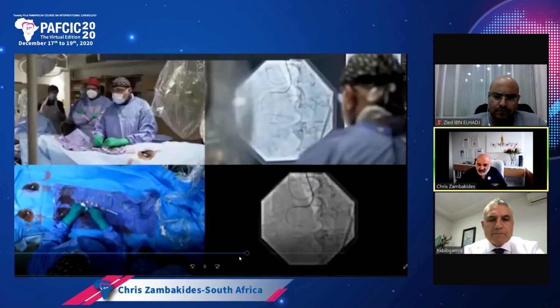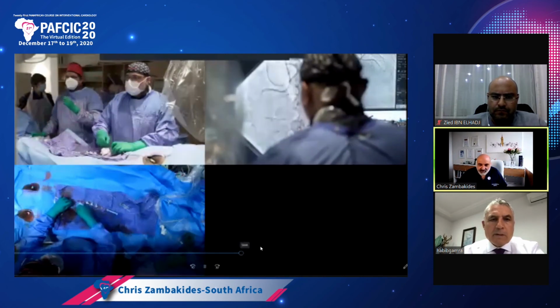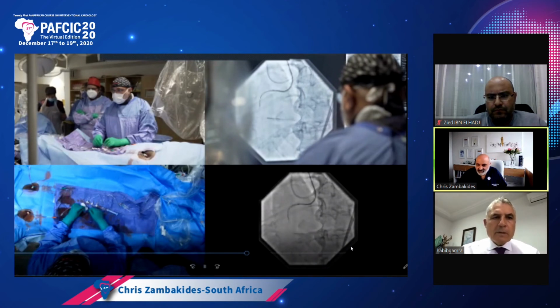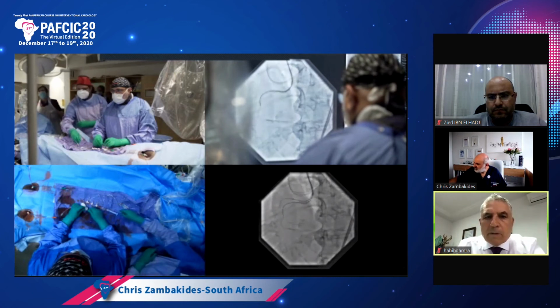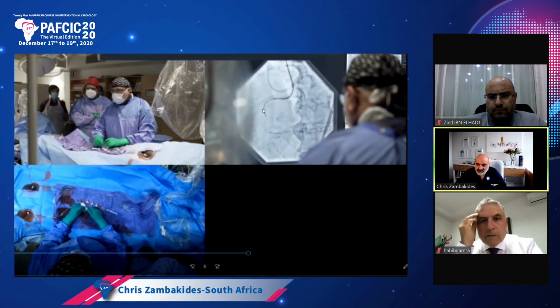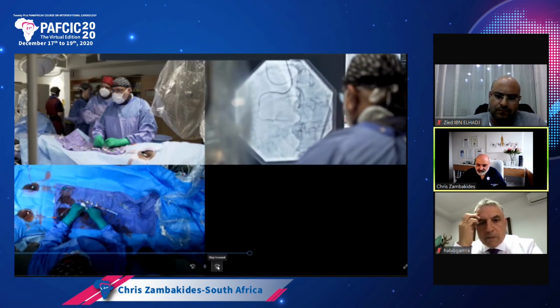So essentially, then PCI. We went antegrade, putting a Corsair microcatheter antegrade with an XTA. That's a little side branch that was taken before, and now we know that we have to redirect down here, and that's the nice thing. You can see that little pathway is actually a pathway we managed to go in the right direction, created on the antegrade by the previous.